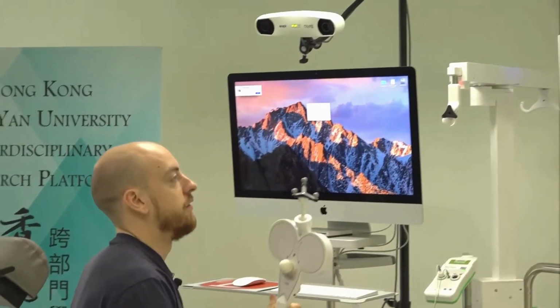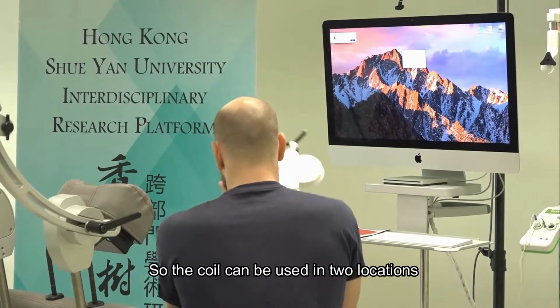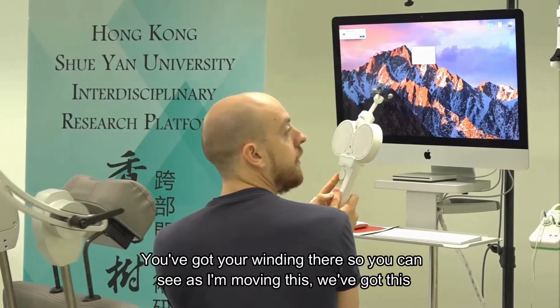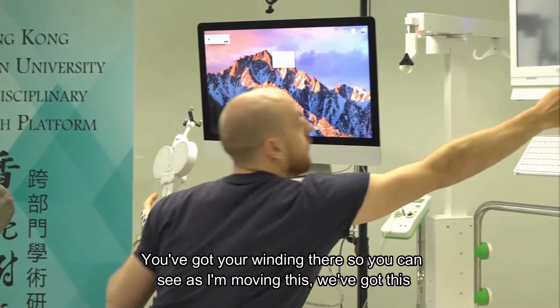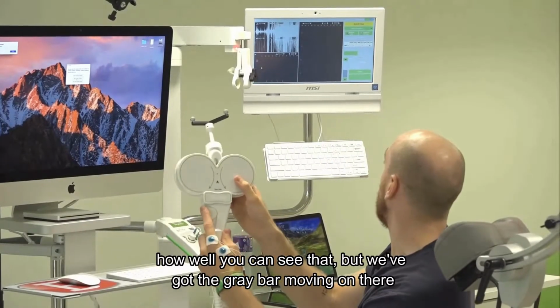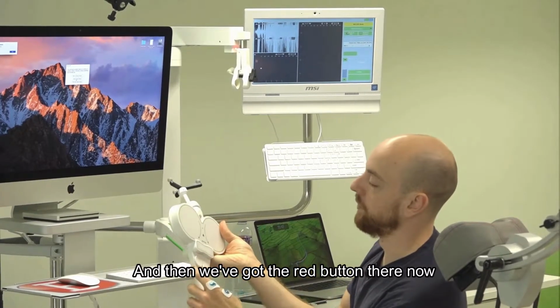So if I just sit down on here. The coil can be used in two locations. You've got your winding there. As I'm moving this, I don't know how well you can see that, but we've got the grey bar moving on there, and then we've got the red button there.